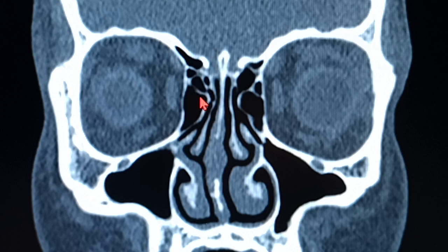If you are operating in a case of chronic polyposis, severe ethmoidal polyposis, already having a presence of a huge supraorbital cell or pneumatization, the anterior ethmoidal artery is obviously going to be dehiscent. The canal will be dehiscent. The artery will be hanging in the mesentery. The artery and the vein are along in the same canal. It's not just the artery, it's the artery and the vein.